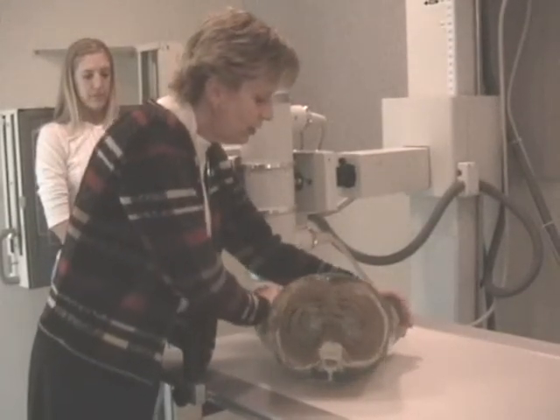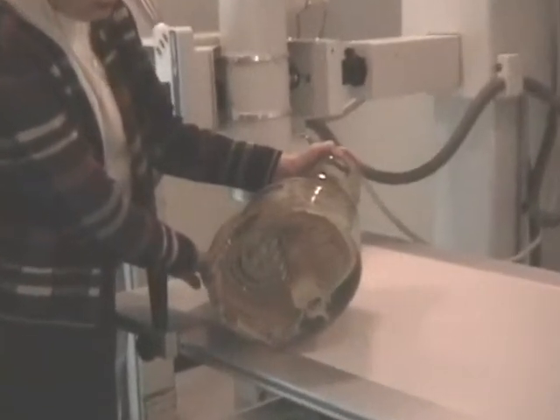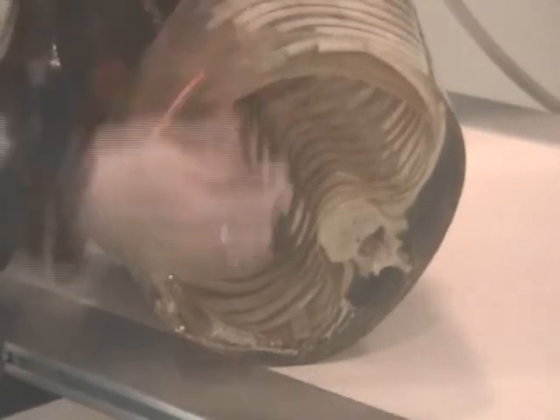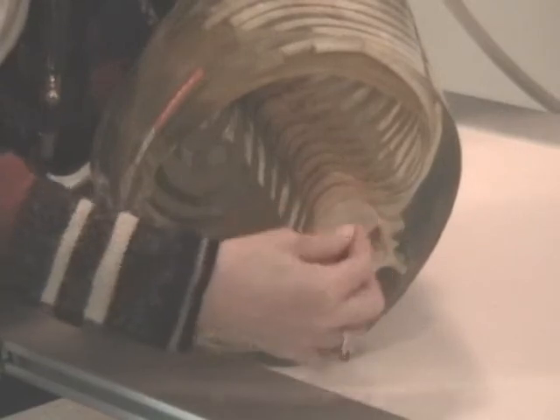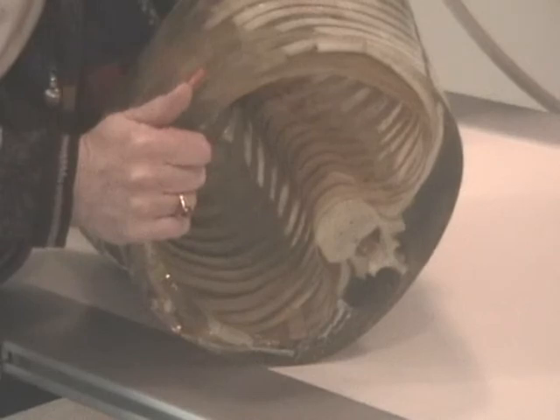I'm going to oblique the patient into an RPO position. And you can look right up this thorax here and take a look how we've taken these lateral ribs and we want them laid out. And then look what happened to the spine. It went over there. The spine is actually now under the left side ribs. These are laid out. These are going to be twice the size, twice the width as this side over here in comparing the distance between the spine and the lateral aspect of the ribs.